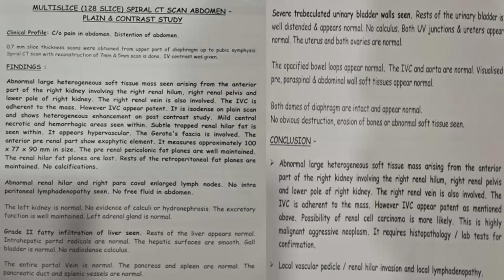This case is showing that it is locally advanced, and the vein is already involved. Then what about the metastasis? There is a role of PET scan in recurrent as well as metastatic RCC, in the metastatic carcinoma. Yes. Tell us.